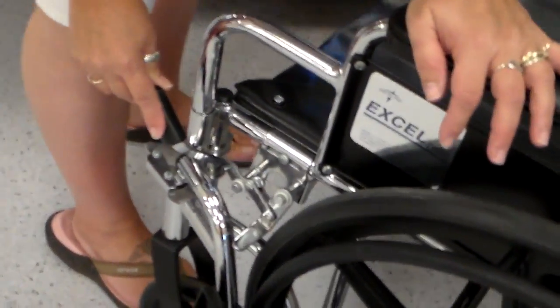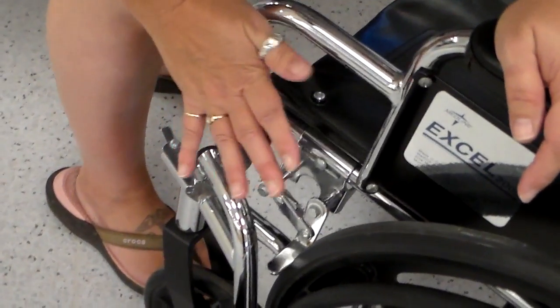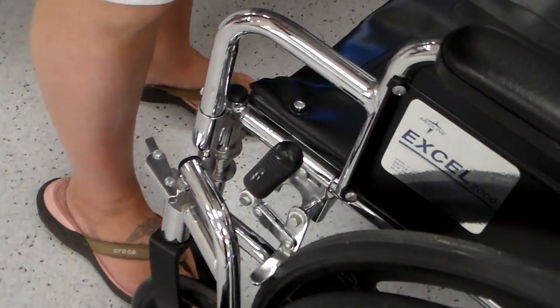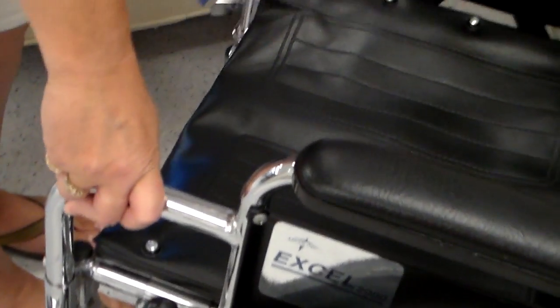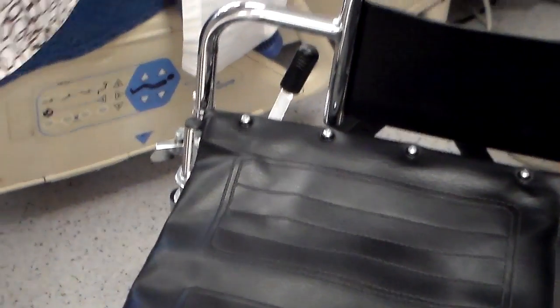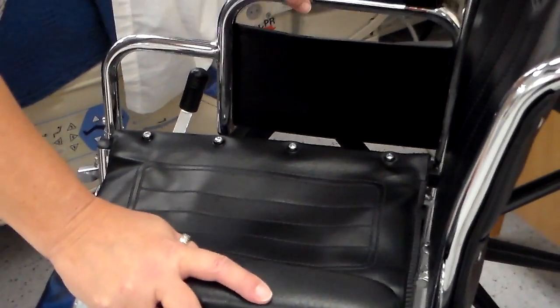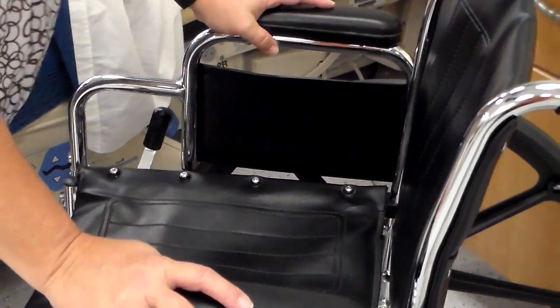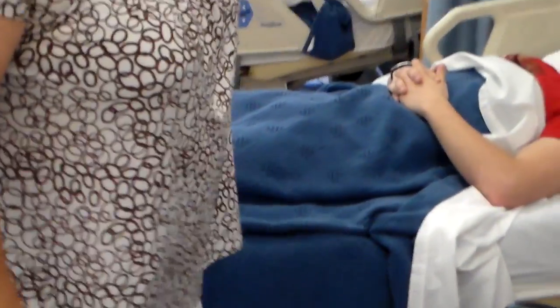We want to make sure the wheels of the wheelchair are locked. There's mechanisms on the side by the wheels. You just push those, and see it pushes right up against the wheel. So you just push that, make sure that both sides are locked. Okay? That makes the wheelchair not 100% stationary, but 95% stationary, okay? All right. So then we've got all that ready.